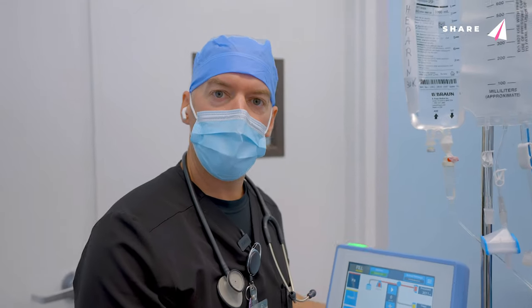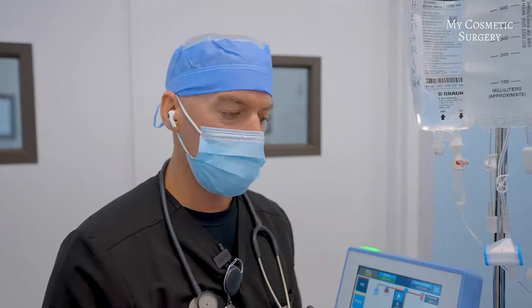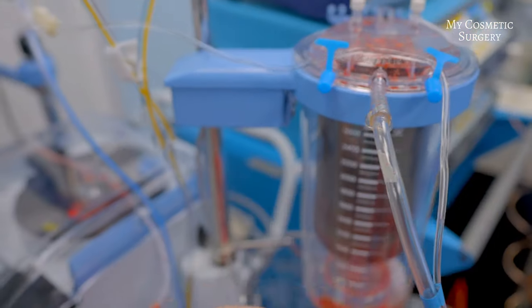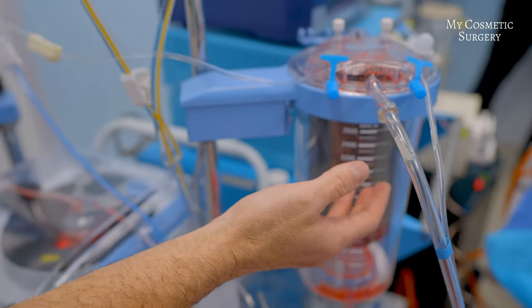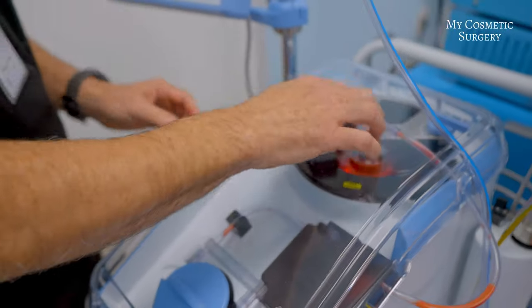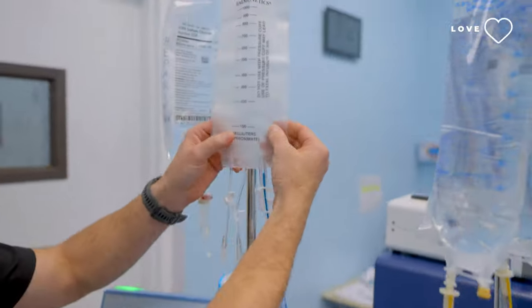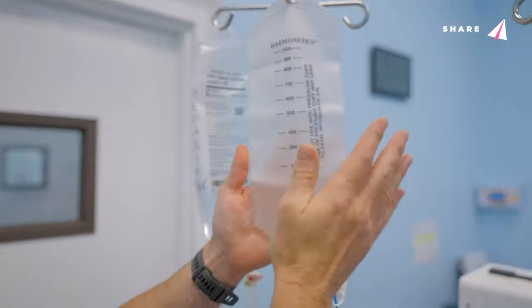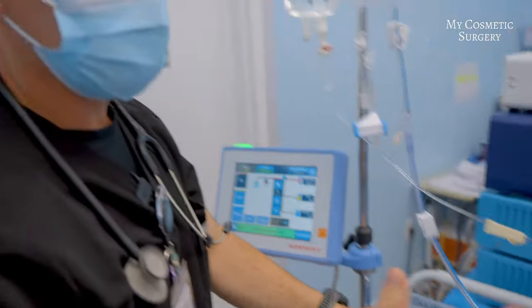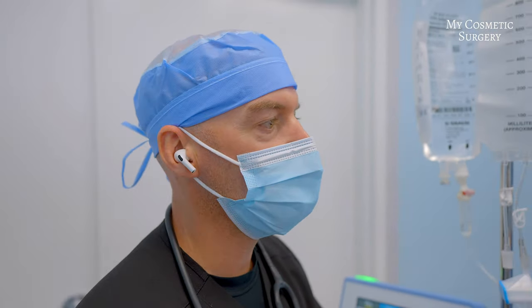This machine is called the Cell Saver. It helps collect the blood and separate it from the fat. This container collects all the blood from the fat, separates it, and what is not going to be used is discarded. What is useful I will collect and return to the patient — meaning if the patient loses a little blood, they don't actually lose it. All the blood that is useful will be returned to the patient.